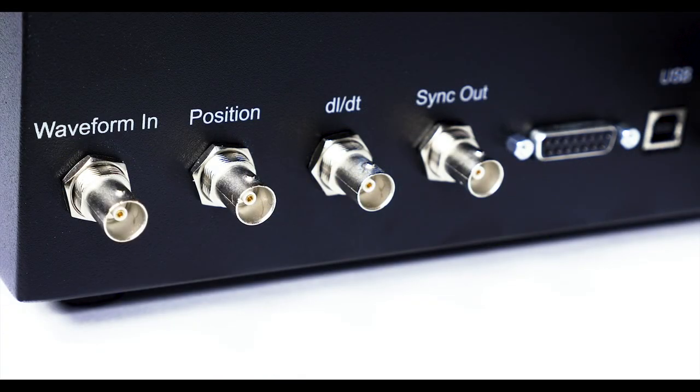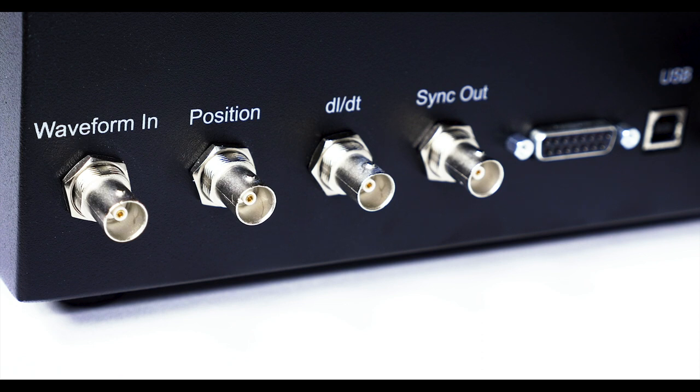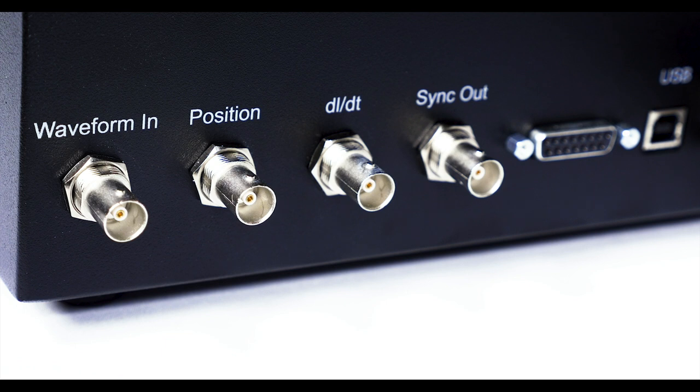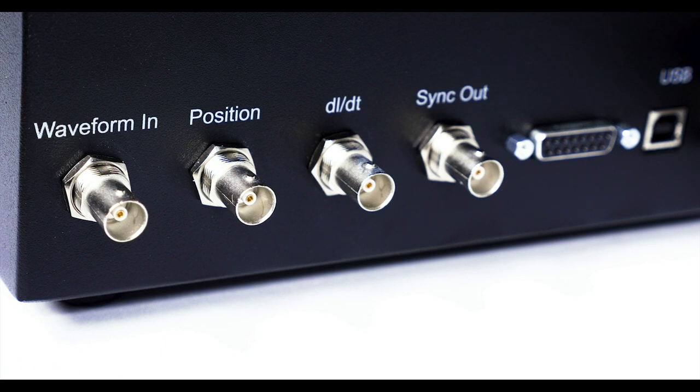Four BNC connectors provide waveform input from an external source, pump position output, DL over DT or piston velocity derived from the piston position which multiplied by the piston area corresponds to the theoretical flow rate, and sync pulse output.